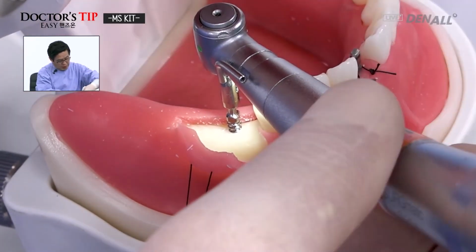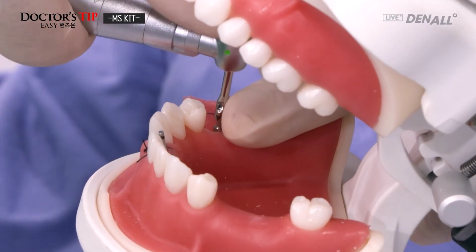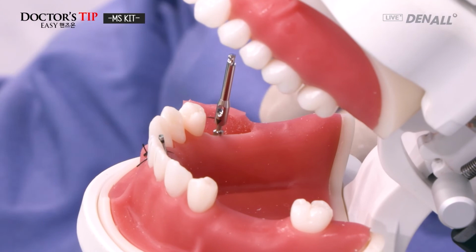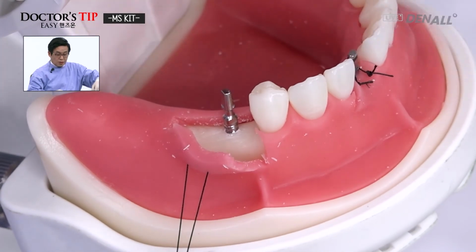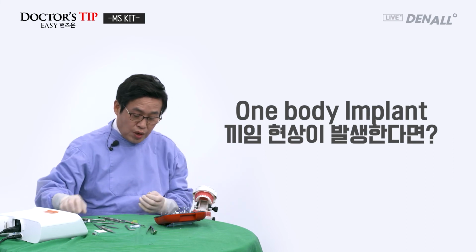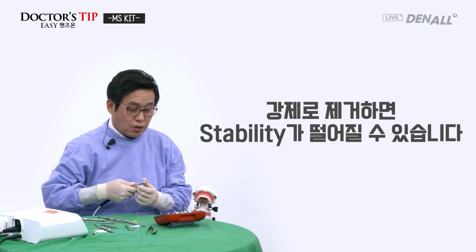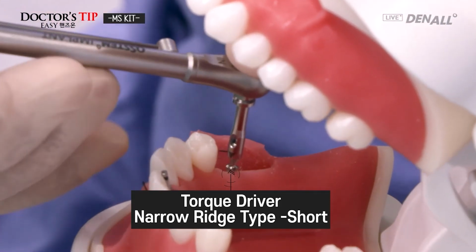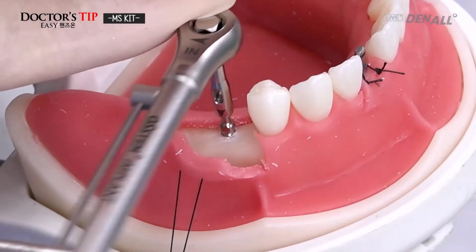And again, here also, excessive torque results in not being able to separate. Then handpiece, removing that is easier. So you remove the handpiece using the separator, push it in, and then you can easily separate the two. Again, because it's one body implant, if there is a jamming, then if you force it out, you will lose stability. So you have to be careful. Depth adjustment. So depth is adjusted.